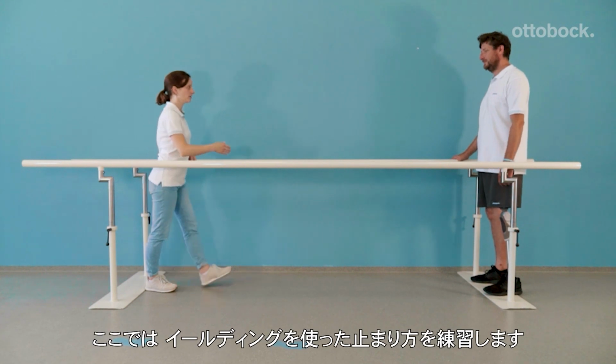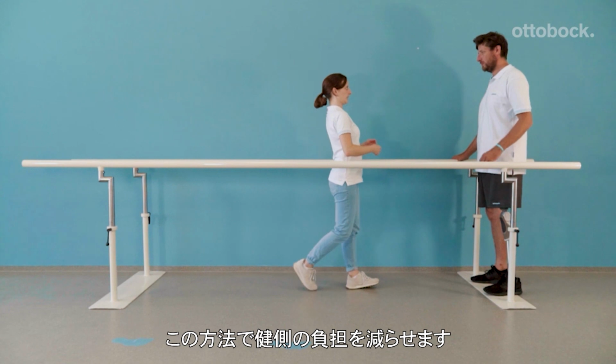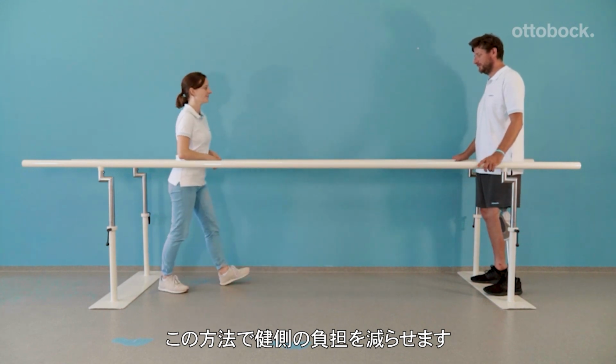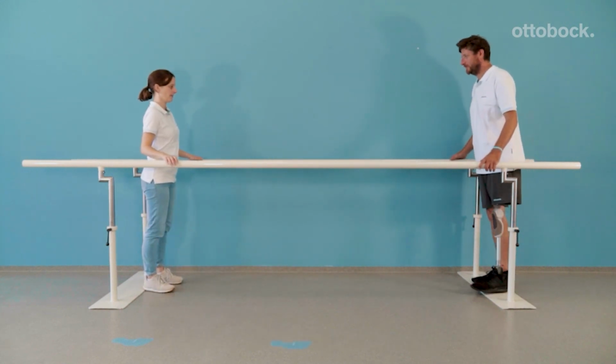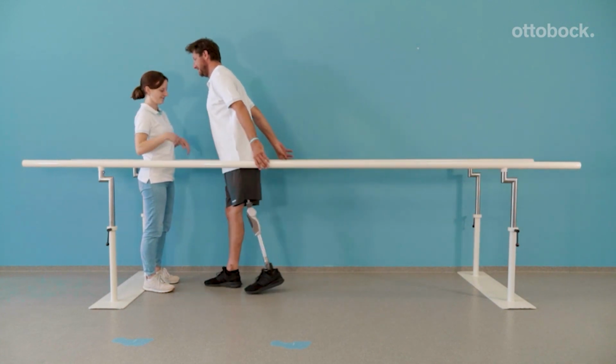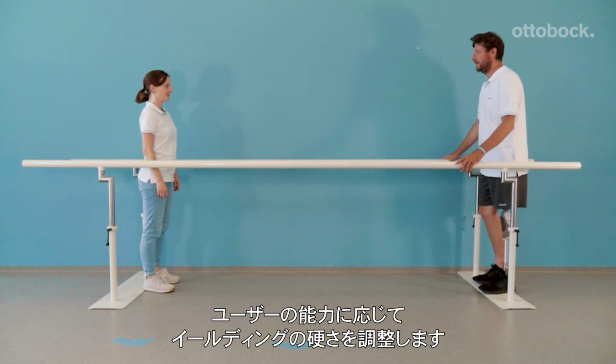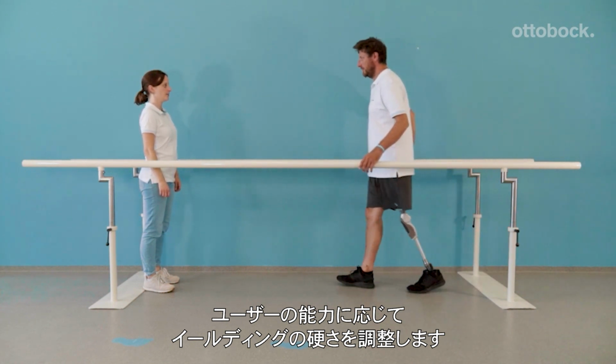In this exercise, our model learns how to slow down using the yielding technique to relieve the contralateral side. When practicing without holding onto the parallel bars, the amount of yielding is determined by his ability to bring the knee into extension.